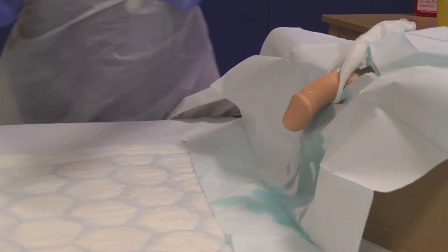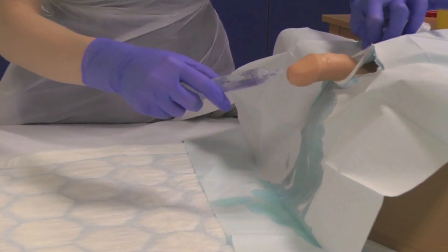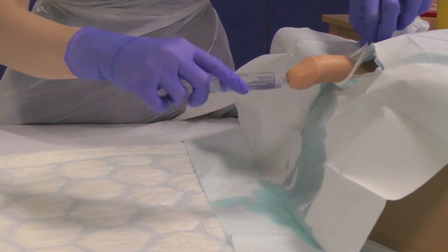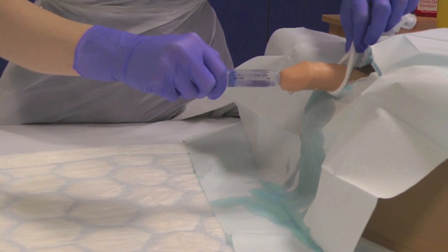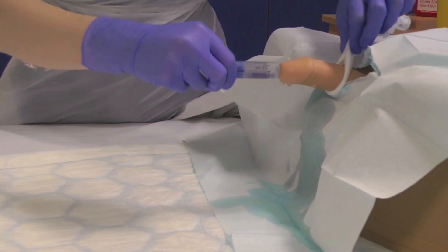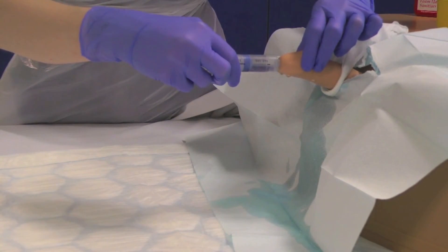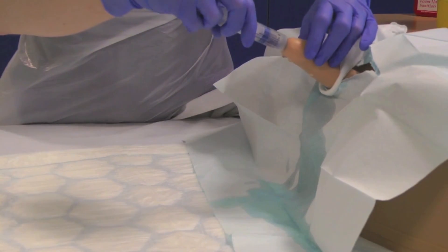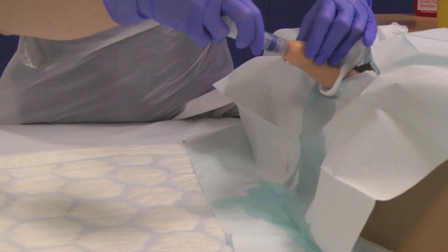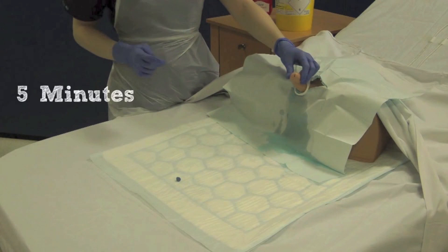Once you have finished cleaning the genitalia, take your Instillagel and, whilst holding the penis erect, insert 11 millilitres into the urethra. Dispose of the syringe into the sharps bin. Gently squeeze the tip of the penis to prevent leakage of the gel, allowing five minutes for the gel to take effect.